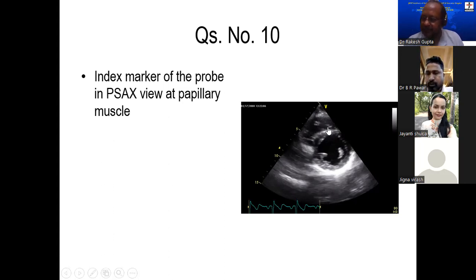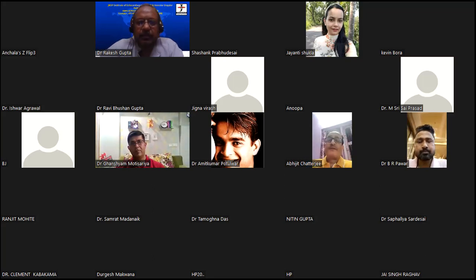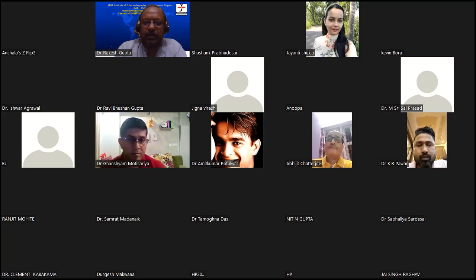Abhijit, are you ready? Dr. Abhijit? Sir, can you hear me? Yeah, I can hear you. Please ask your next question. Dr. Ranjit. Sir, I don't have pictures with me. You can ask the question directly. Yes, sir. Sir, please show the picture. Okay, shall I share my pictures? Yes, sir.